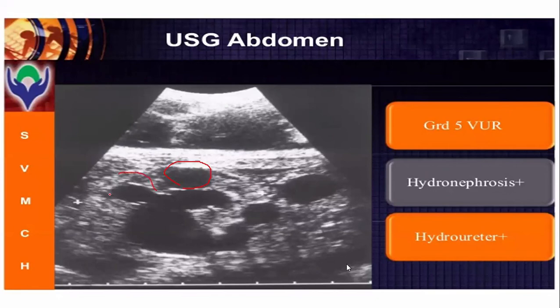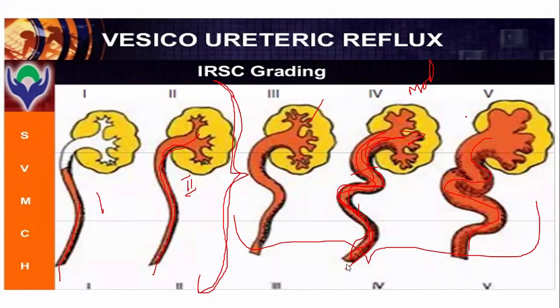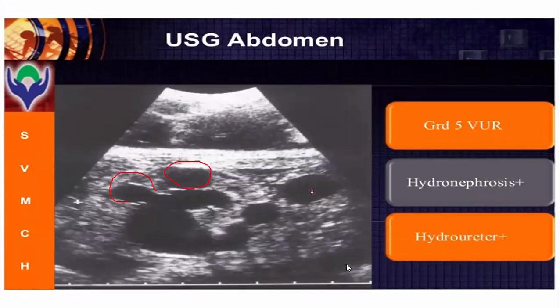They are already very circular. So it reminds you of this one, doctor. Look at this. So he has a severe hydronephrosis of the kidney with tortuosity of the ureter. Dilated. As I told you, if the ureter can already be seen, it means it is dilated. Normally, the ureters cannot be seen in ultrasound because they are not dilated and are covered by bowel gas. But once you see it big, the ureters are really dilated. So that is stage 5.